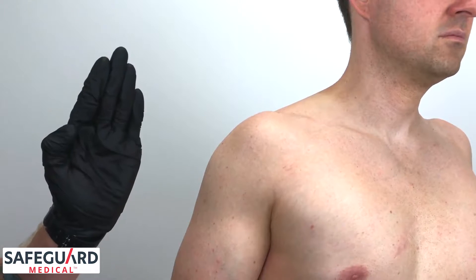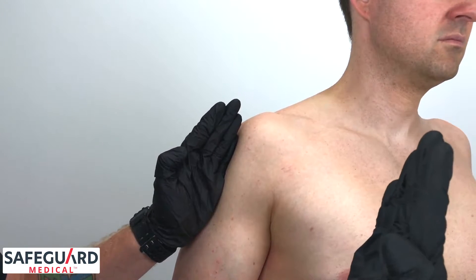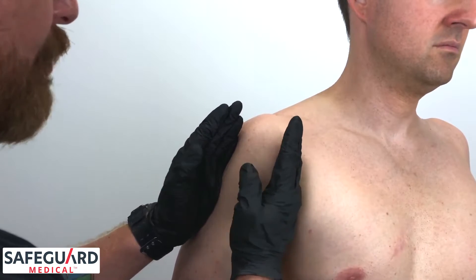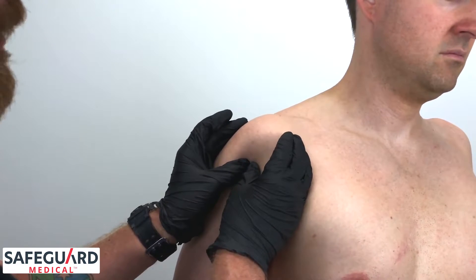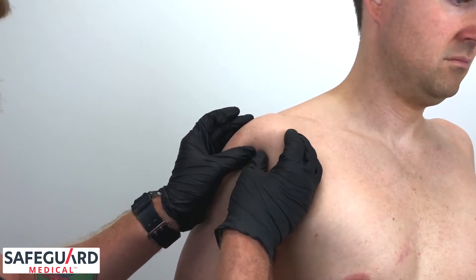With one hand, form a knife cutting edge and bisect the arm at the deltoid. With the other hand, form another knife cutting edge and bisect the axilla anteriorly. Rotate both hands inward until the thumbs meet. Palpate the surgical neck of the humerus and move upward until you locate the greater tubercle.